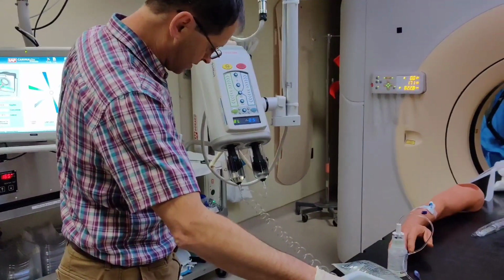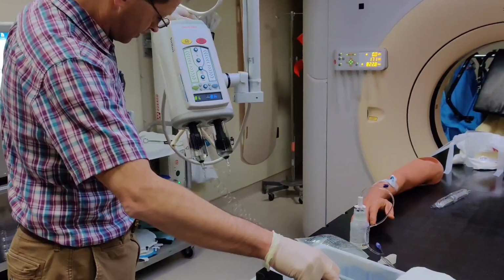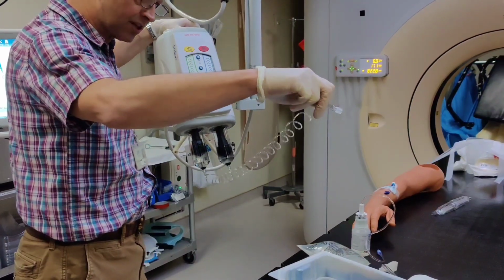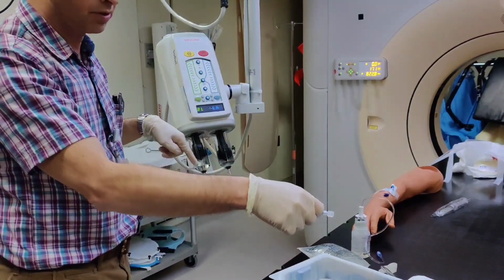And this takes more than you might think, which is why, there we go. And now there is actually saline dripping out of there, so I know I've got the entire system primed.